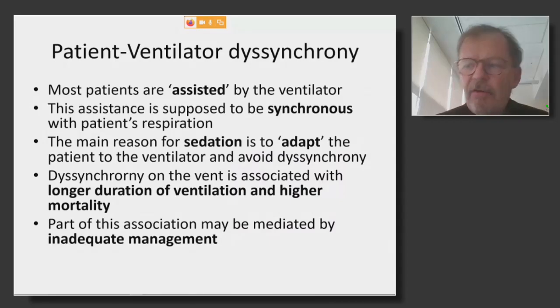In reality, this synchrony is not always good, and in fact, this is one of the main reasons to give sedation. We say it is to adapt the patient to the ventilator and to avoid desynchrony. But desynchrony on the ventilator is associated with a longer duration of ventilation and even higher mortality. So it's an association, but it says that there is something wrong here. And maybe it's also because we don't adequately manage the patients, either in terms of sedation or in terms of ventilation.